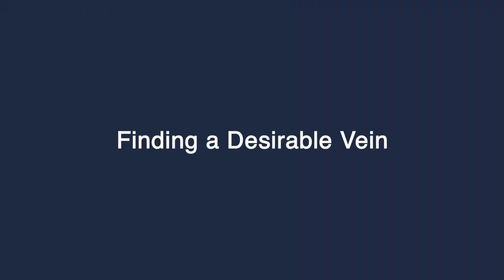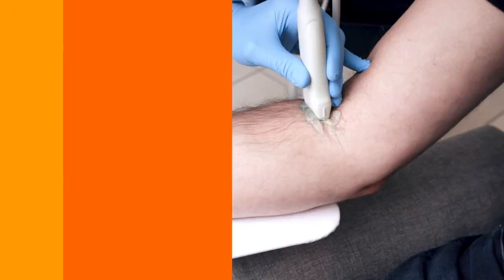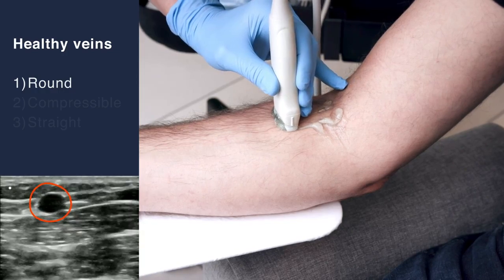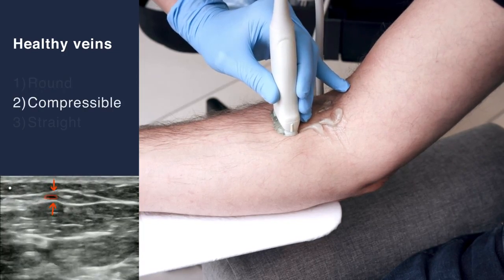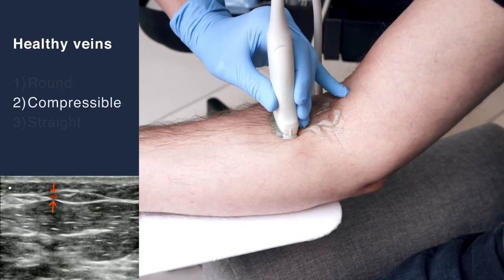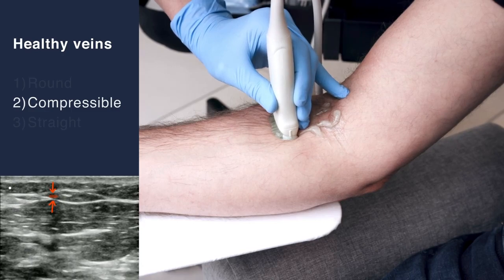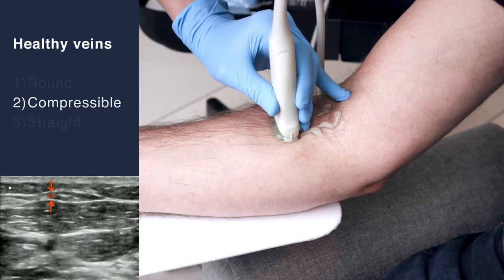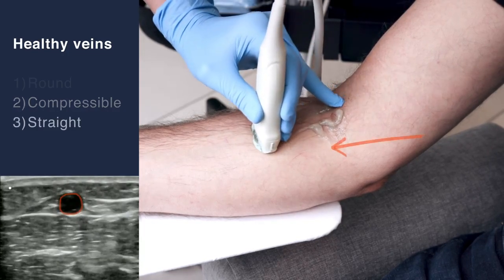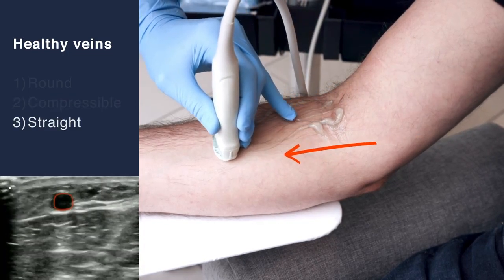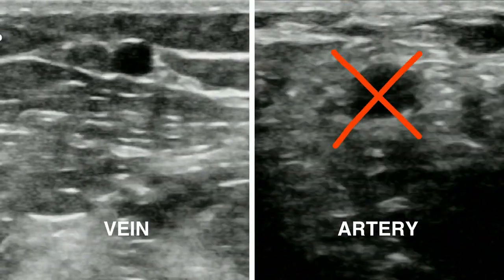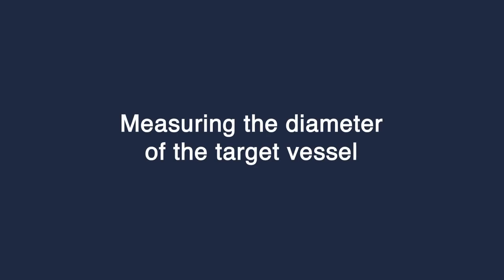Finding a desirable vein: healthy veins are round, compressible in the transverse view, and are straight in nature when traveling down the extremity. If your vessel is pulsating, it is likely an artery, not a vein. Move on to another vessel, measuring the diameter of the target vessel.